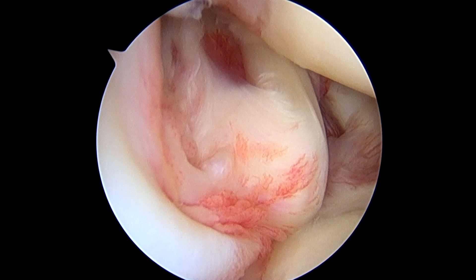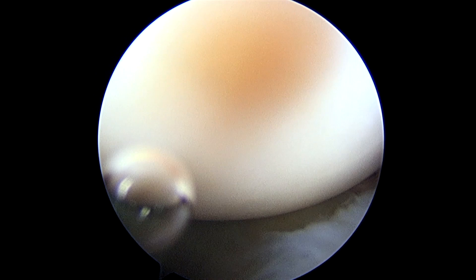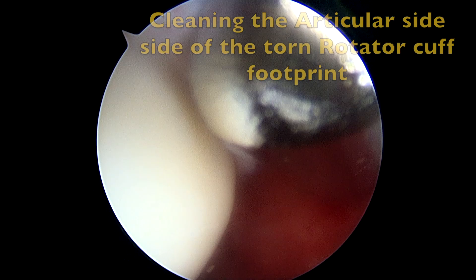Here we see the biceps tendon is normal, although it does have a capsular band attached to it. The rest of the joint is visualized in a very systematic manner to allow documentation of any other pathology.